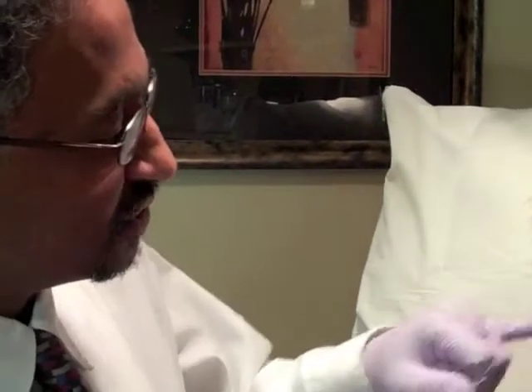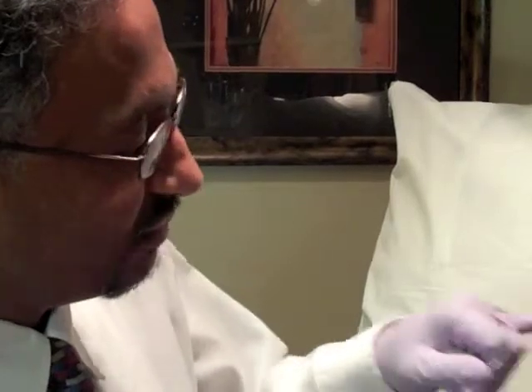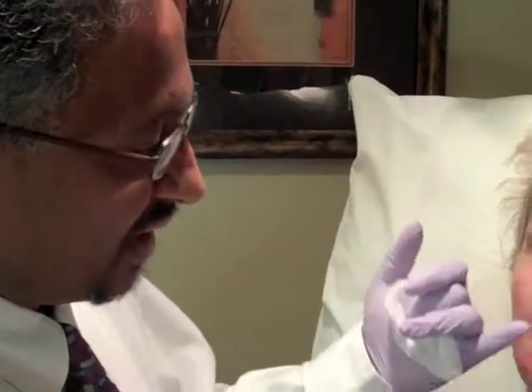Now we're going to focus on the upper lip. Nadine's had her lip done many times and her lip is quite well preserved with dermal filler, particularly hyaluronic acid. They last from 6 to 7 months and then start fading away, and she just wants a top up of her filler to preserve the shape of her lips which she quite likes. Our whole purpose is to make sure the cupid's bow and the philtrum are nicely maintained, the pillars are nice, and the vermilion border edges are maintained to give the shape which she has.